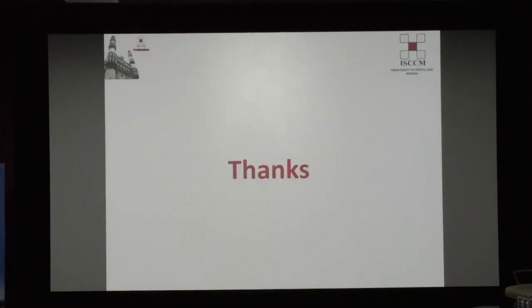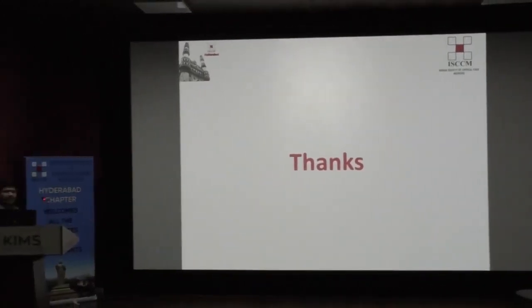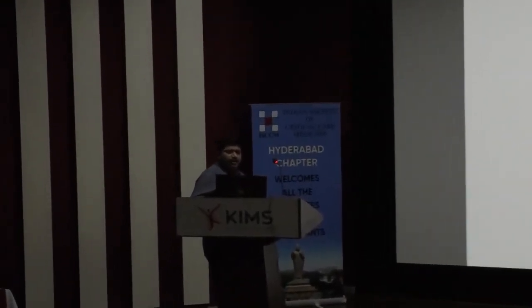The take-home message from this presentation is that, with whatever simple techniques we have, the arterial waveform is one of the most useful waveforms you can have on your monitor. Make it a habit to look daily not just at the pressures, but also to study the waveform very carefully, because the waveform can give you much more information than whatever you can see in the patient.